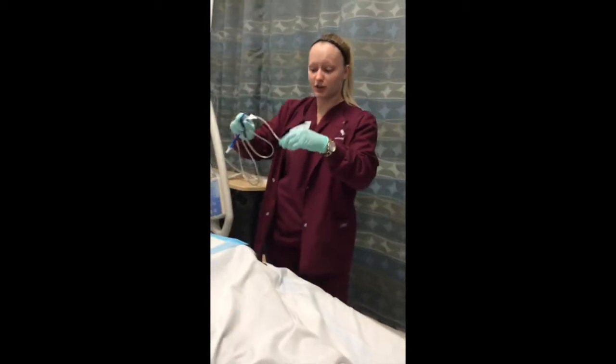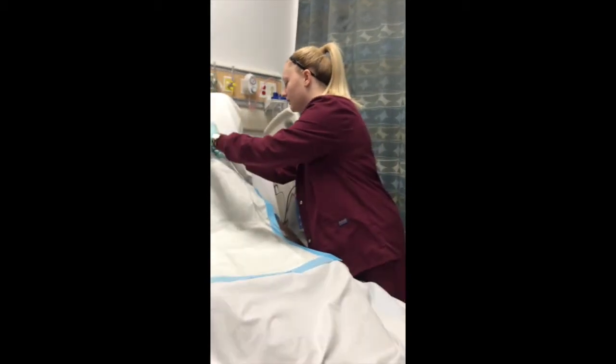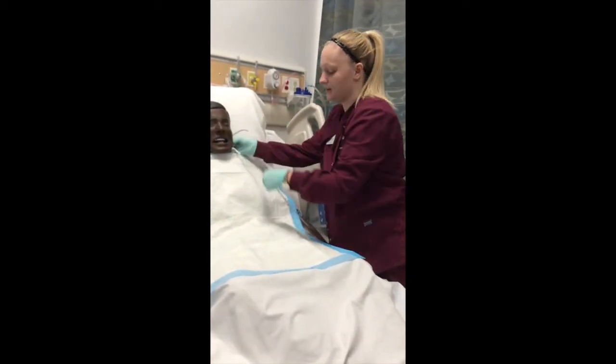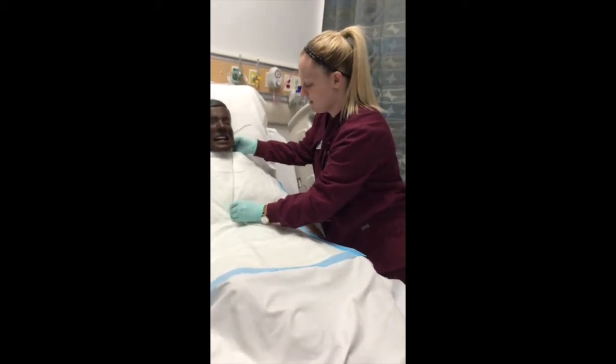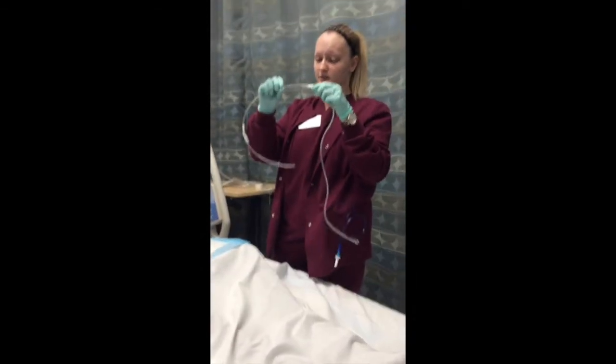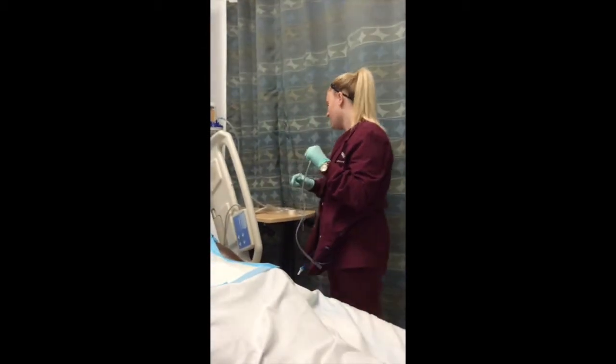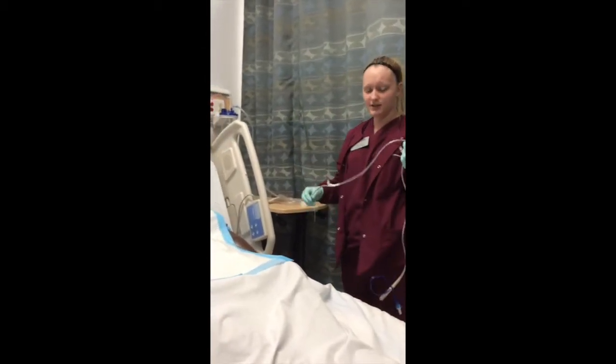So I'm going to first measure. I'm going to measure from their nose to their ear to their xiphoid process, so NEX. Okay, so I have about 52 centimeters. So I'm going to go ahead and tape that. I got my tape here. So I've already taped and marked where I need to insert it.